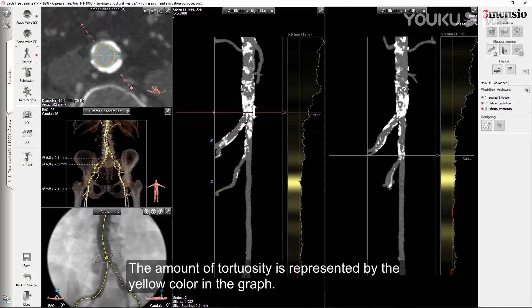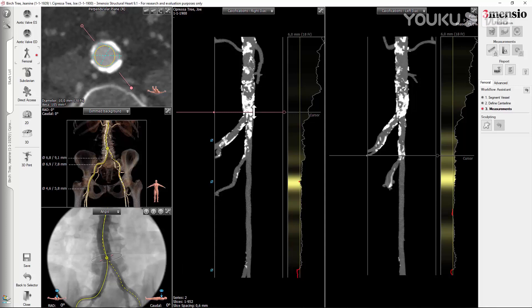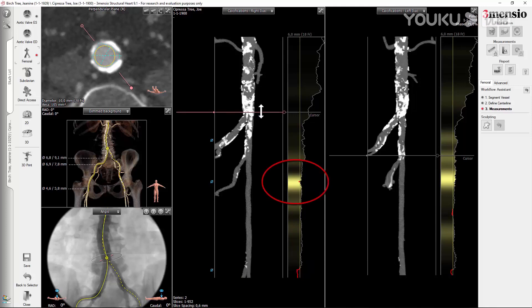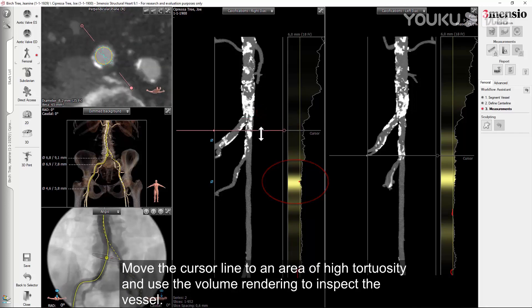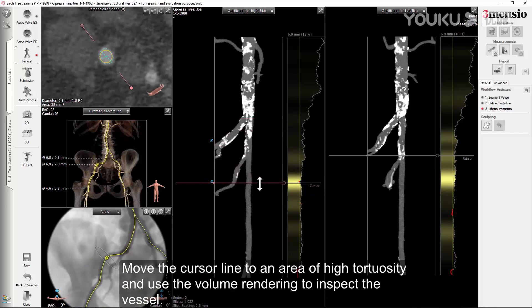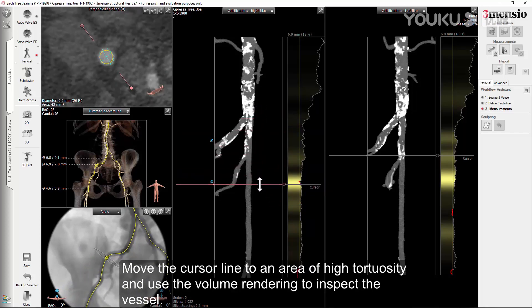The amount of tortuosity is represented by the yellow color in the graph. The brighter the yellow, the higher the tortuosity. Move the cursor line to an area of high tortuosity and use the volume rendering to inspect the vessel.